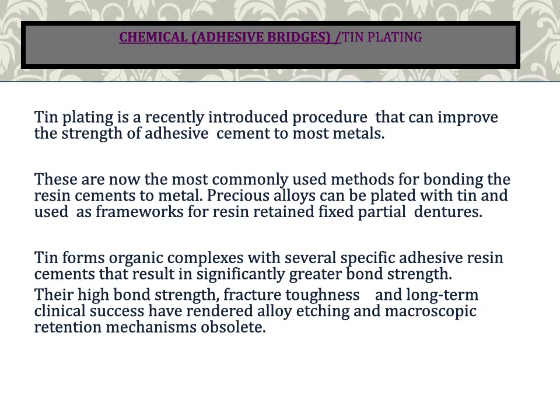The next that we'll be discussing are the adhesive bridges, which make use of chemical retention or tin plating. Tin plating is a recently introduced procedure that can improve the strength of adhesive cement to most metals. These are now the most commonly used methods for bonding the resin cements to metal.